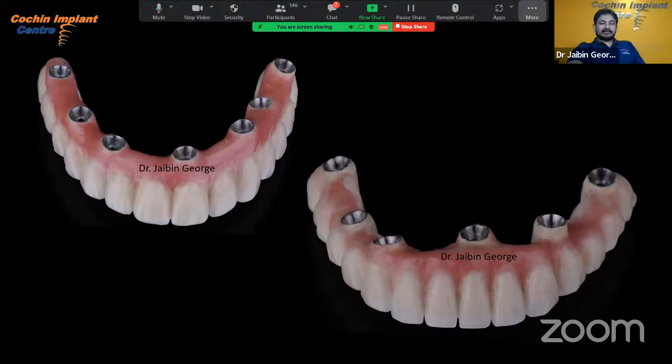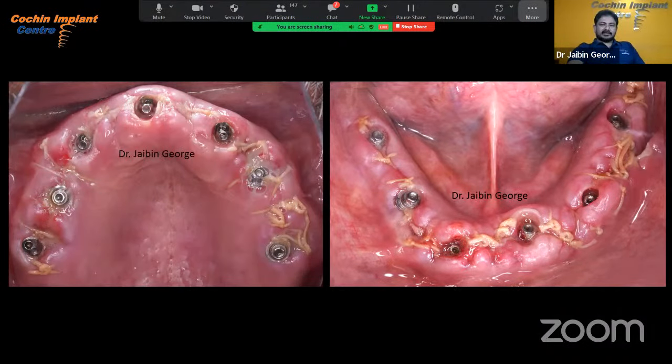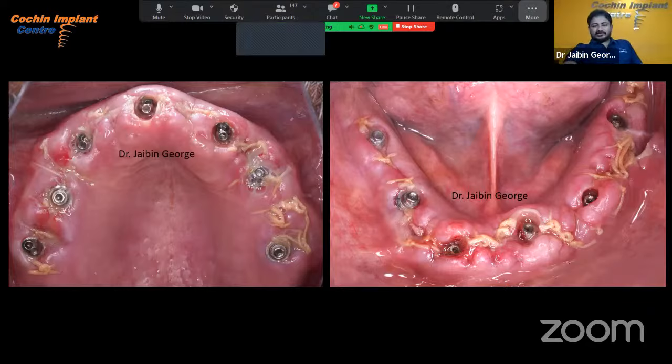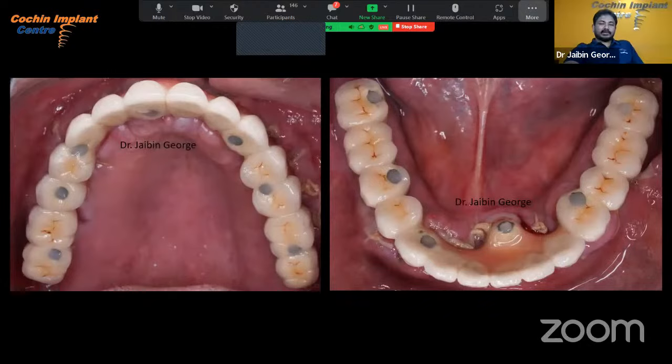So this is the prosthesis which we made. On the second day, this was ready. After the surgery, we made impressions and our lab made this prosthesis. You can see the unhealed tissue. This is the third day after surgery. You can see the multi-units also. This is the screw retained prosthesis delivered on the fourth day after surgery.